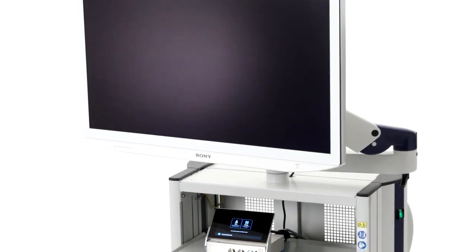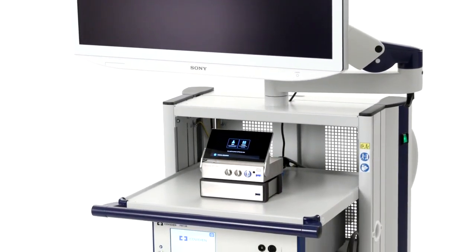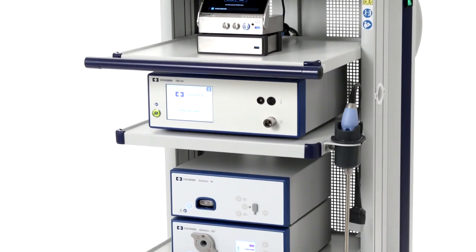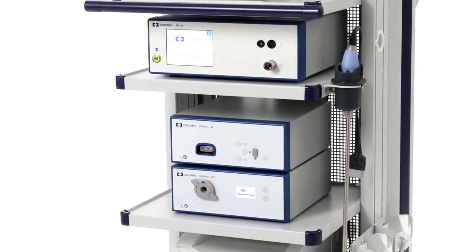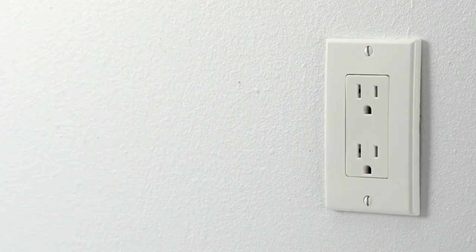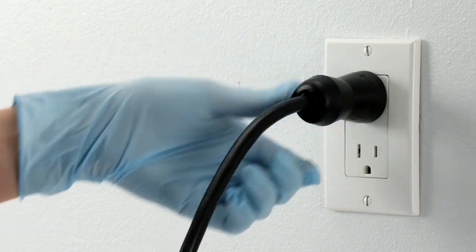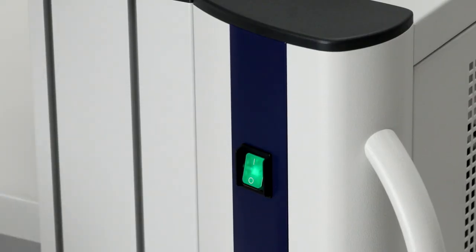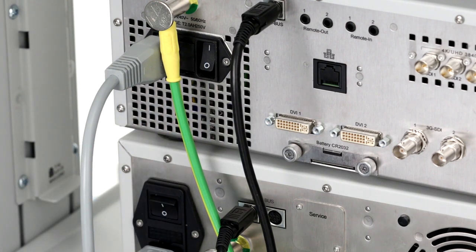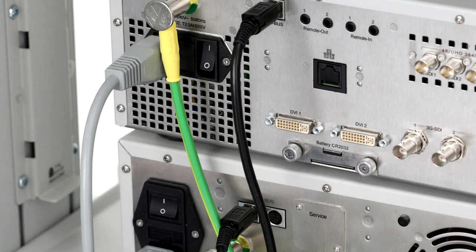Now that you've completed your installation, it's time to program components and perform initial operation and function checks to make sure all devices are in full working order. Ensure that the cart's main power cable is connected to a wall plug and switch the cart's main power on. Power on the CCU and light source using the power switches at the back of each device. This step will bring the light source to standby mode.